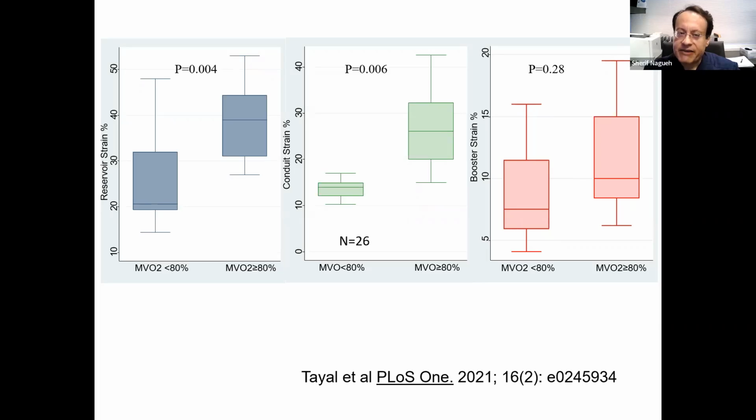So the guidelines advocate that if you have a decent signal with atrial strain and your lab has been doing it for some time, and you are doing it with the same ultrasound system, it is very reasonable to report atrial reservoir strain along with the other findings in the echo report.